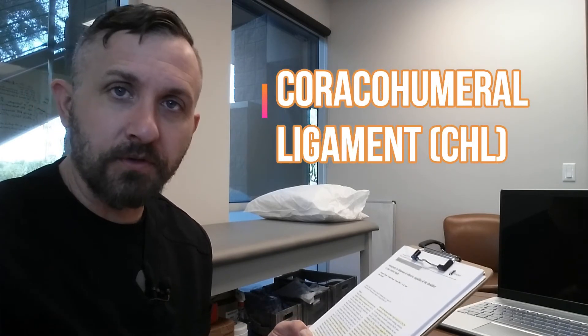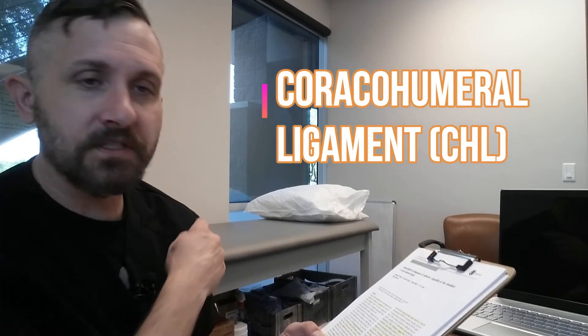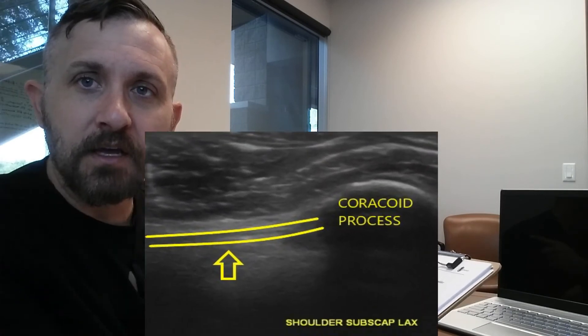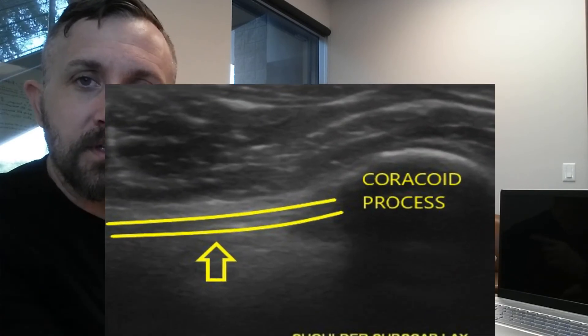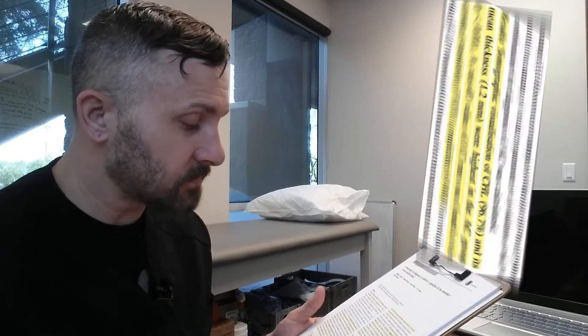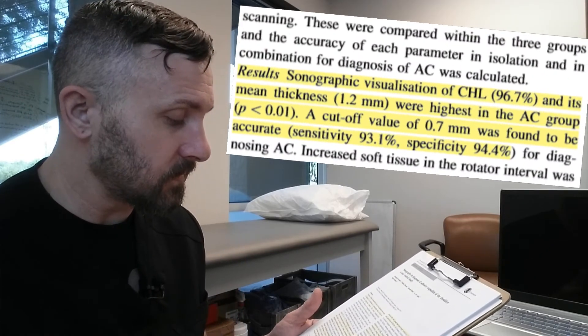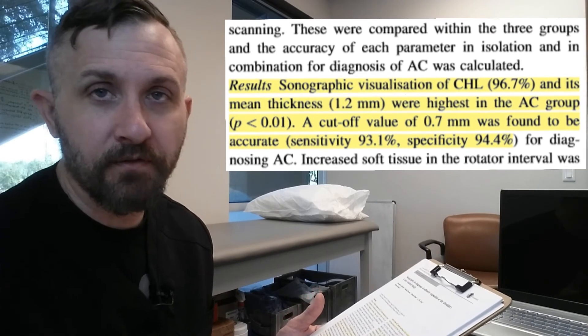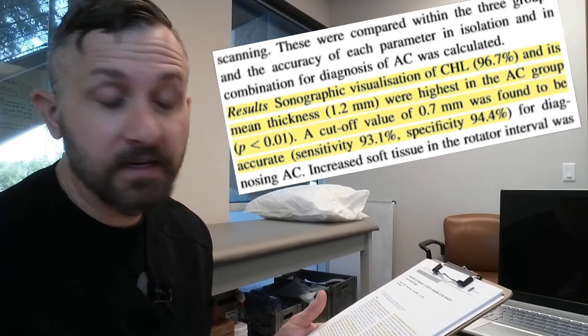The other main criteria is using the coracohumeral ligament, which is the small ligament that goes from the coracoid process — lying just superior to the subscapularis — and runs over to the humerus. The sensitivity and specificity on this is 93.1 and 94.4 respectively.